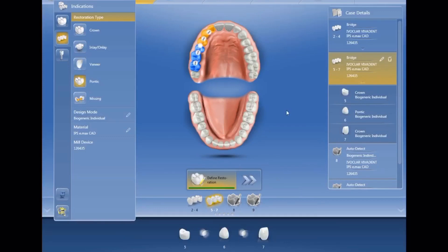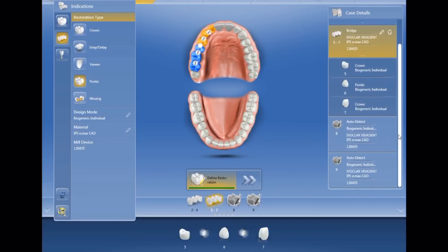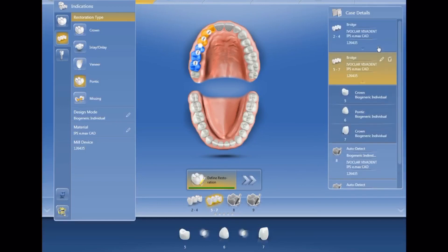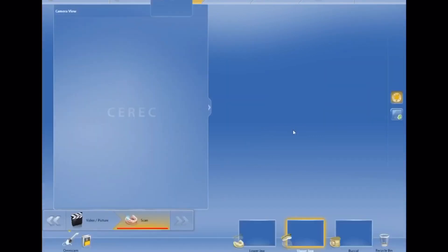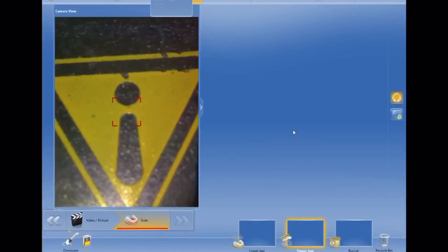Now we have two independent bridges showing up on the bottom — fairly simple, fairly straightforward. You can also confirm on the right side of the screen that there are two individual bridges: two to four, and five to seven. I learned something new from this case.